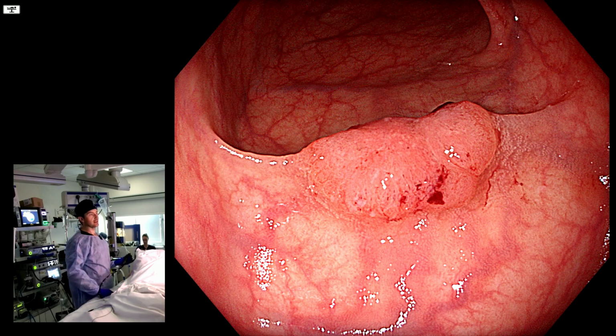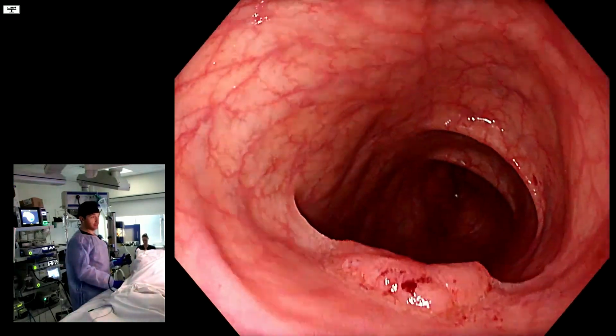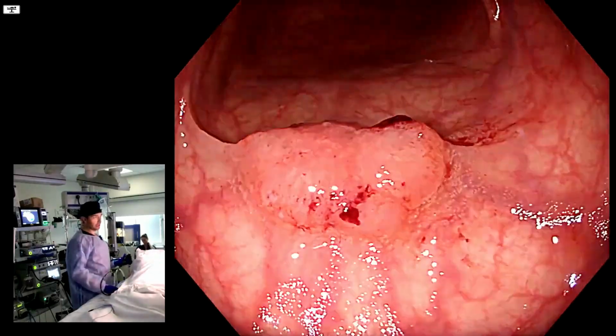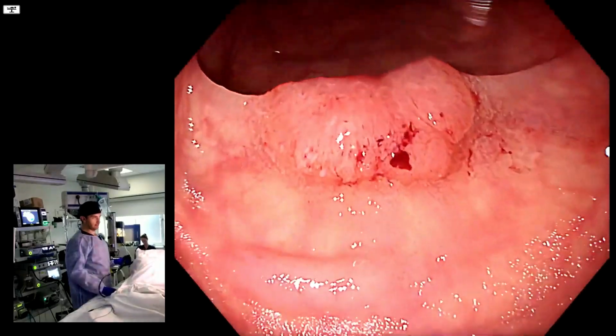So, what do we see in this image? Well, in this image we see, and I'll show you the individual features separately in a second, but I'll just list them: extra redness, spontaneous bleeding, chicken skin mucosa, and perhaps depression. Let's get into it. So we've done all that from just freezing the image, when you first see it. And that's why we call it first impression, because it should be, okay, I've seen this thing, my first impression is that it's got how many of the 6? And we showed nicely in a cohort of over 150 general endoscopists that this works, and that more than 2 of those features indicates the presence of cancer, and invasive cancer within the polyp.